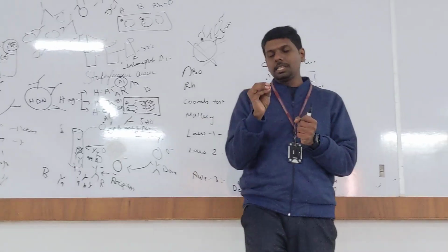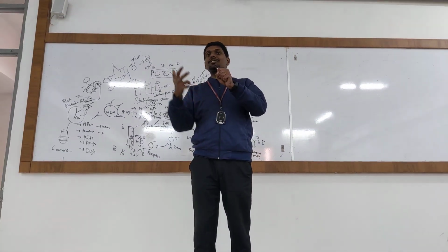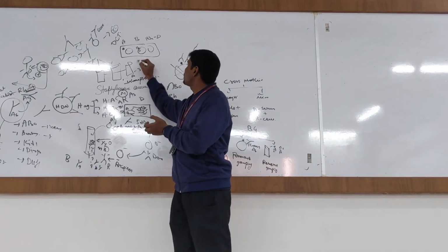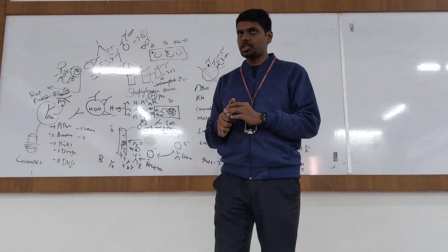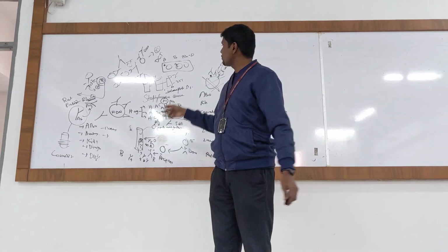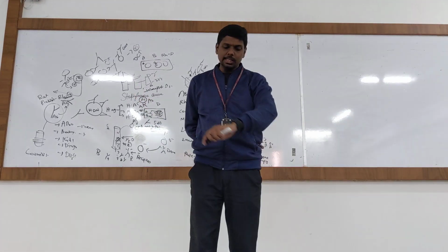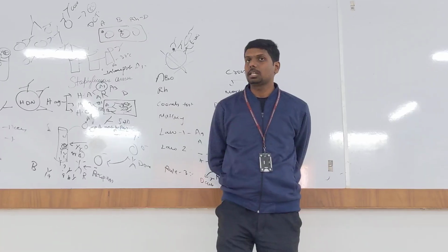During this half hour incubation at 37 degrees centigrade, the cells will be sensitized by their own antibodies. After this, we will add our Coombs reagent. Such a test is called the indirect Coombs test. In the indirect Coombs test, we are adding this one incubation phase to the test.